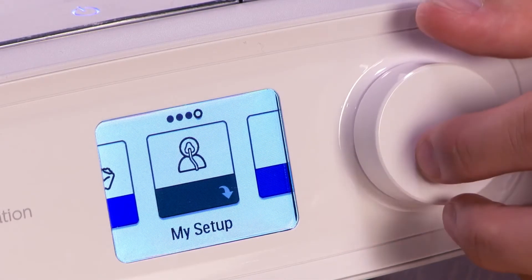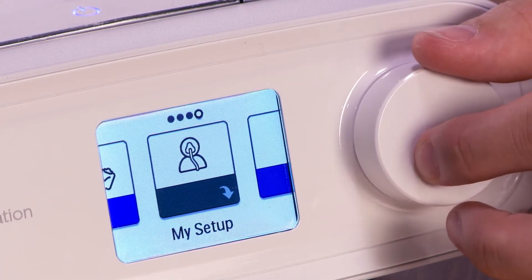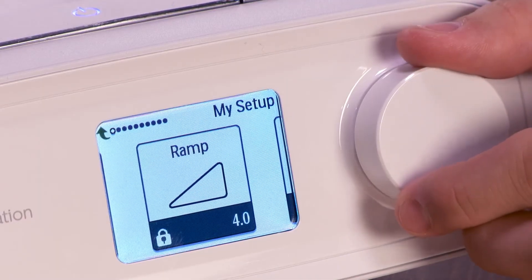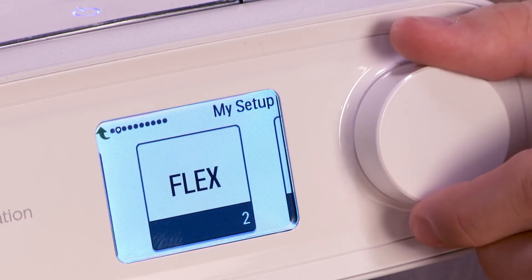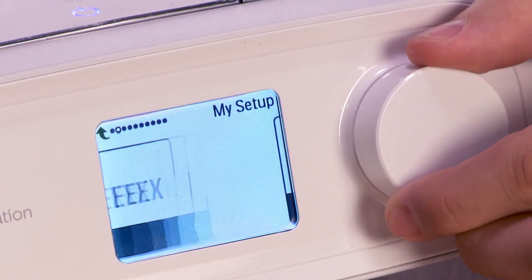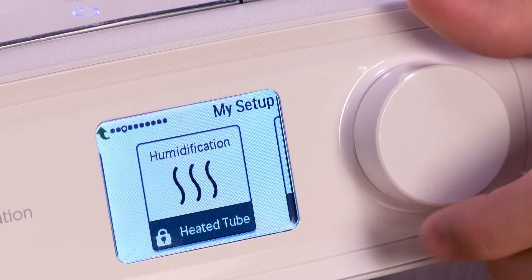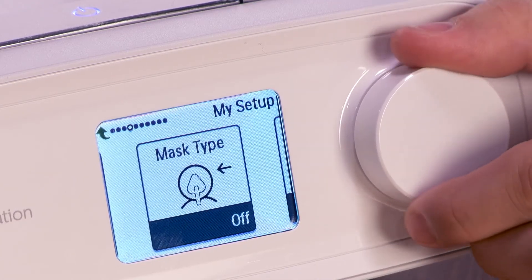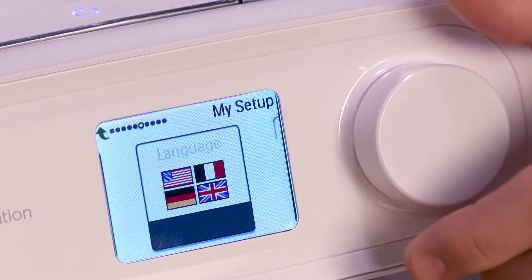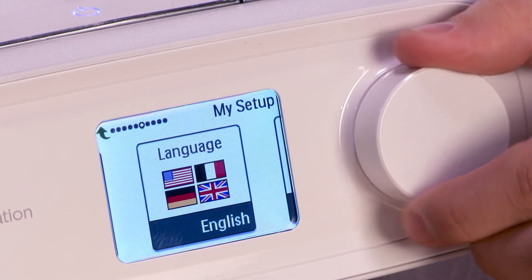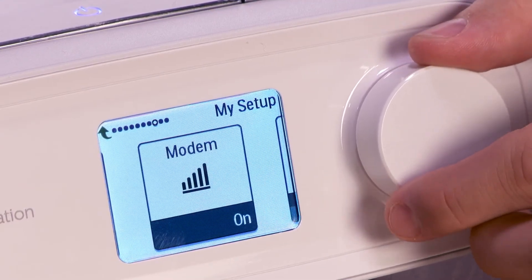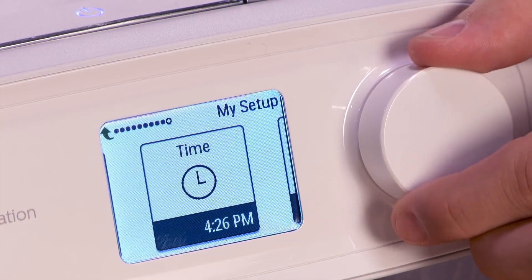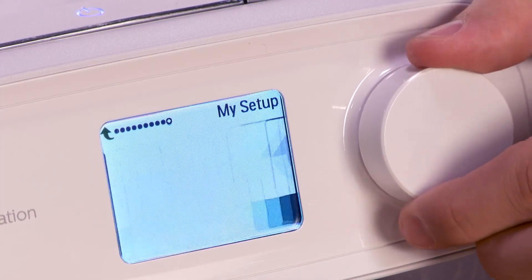Most of the settings you can adjust are under the My Setup icon. This includes comfort features such as ramp and flex settings, as well as humidification modes. You will only see screens for features that are enabled on your DreamStation device. When you are done reviewing and adjusting My Settings, rotate and press the dial to return to the home screen.